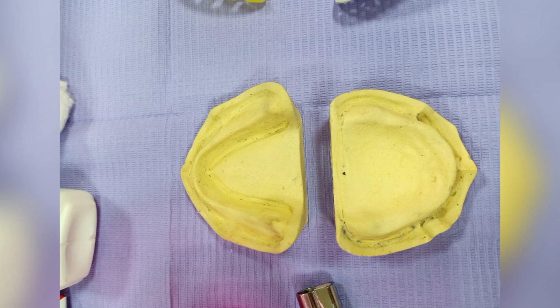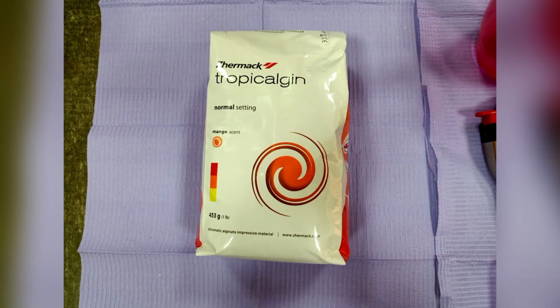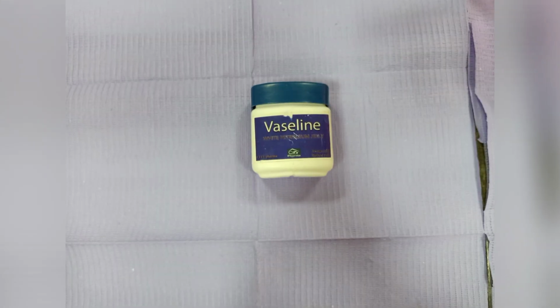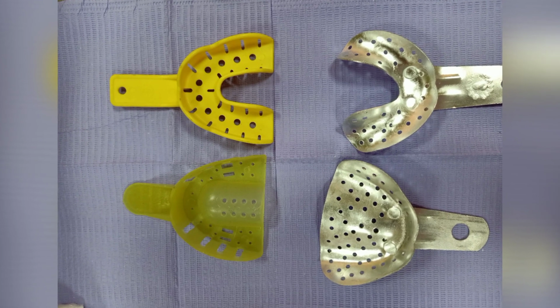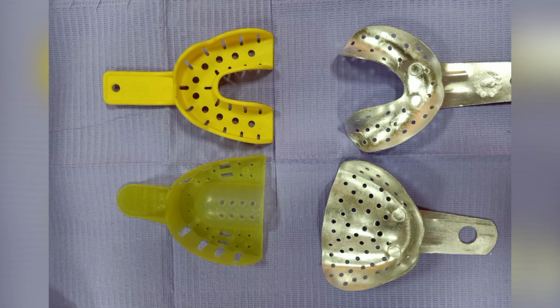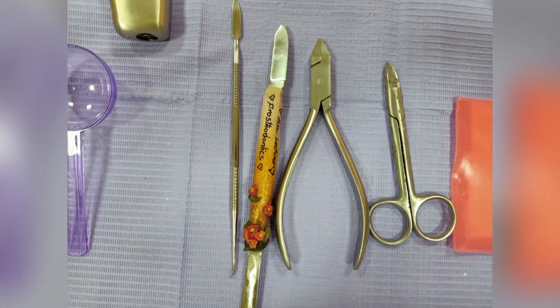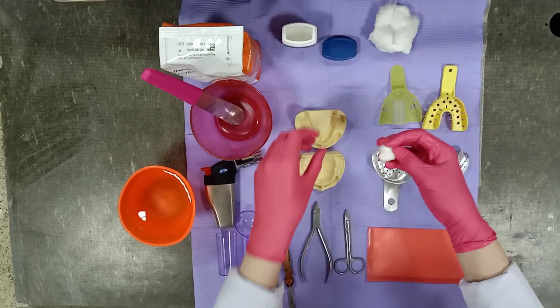The edentulous cast, measuring scoop, alginate impression material, rubber bowl and mixing spatula, Vaseline, proper size stock tray, either plastic or aluminum, wax sheet, carver, knife, pliers, and scissors. Now let's start our work.